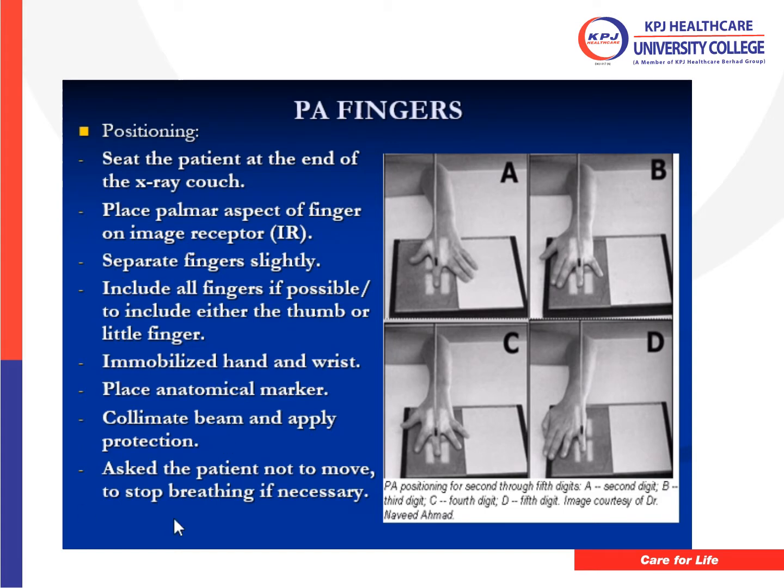This kind of positioning of the patient is needed to ensure that the radiograph we produce is without repeats, without artifacts or anything else.